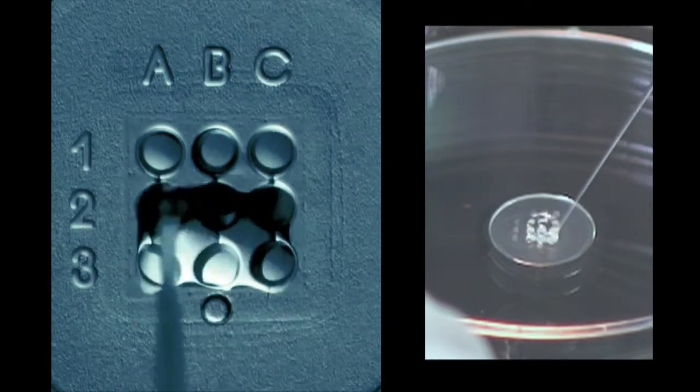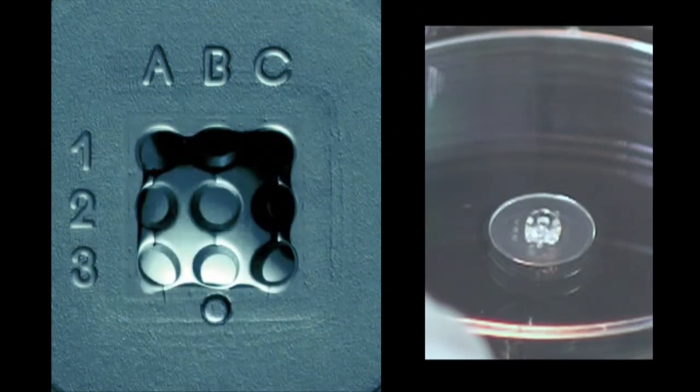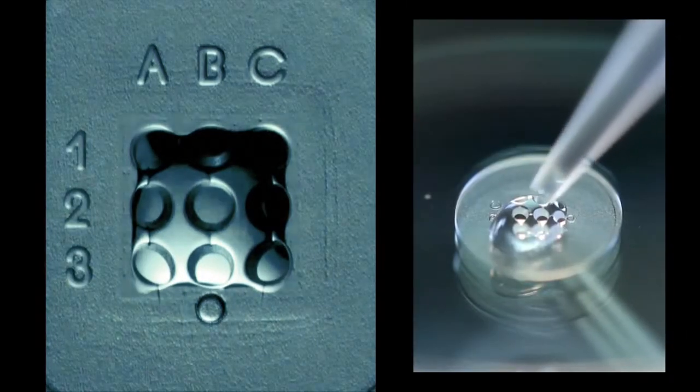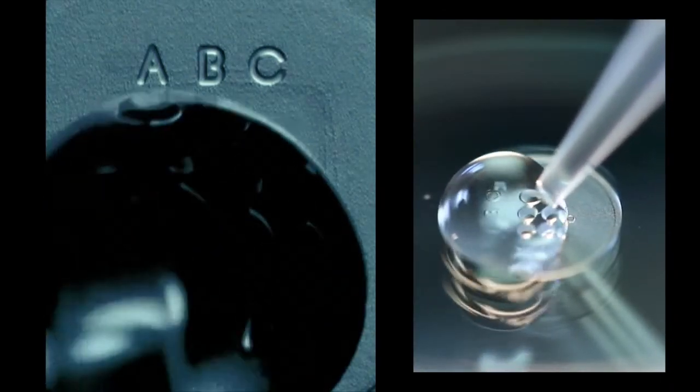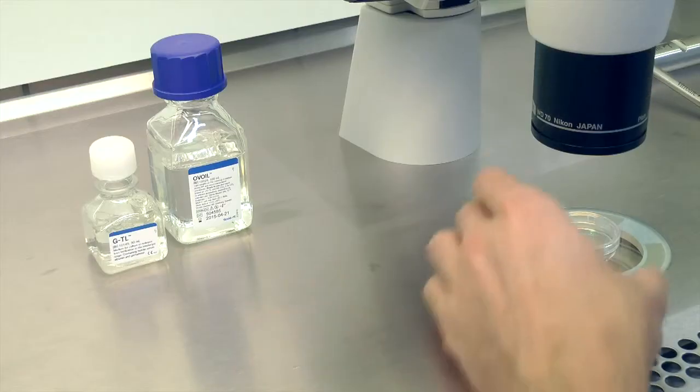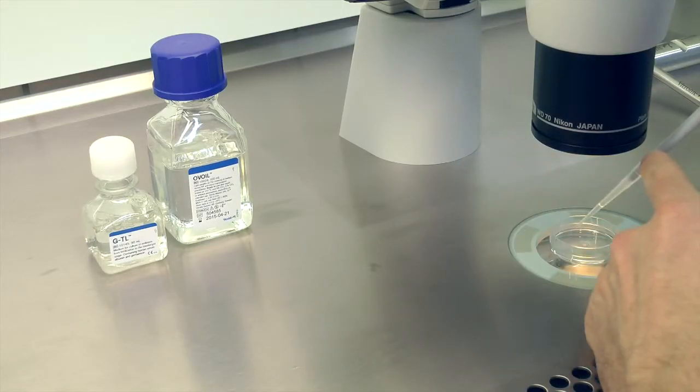The rim around the microwells does not mark the edge of the proposed culture droplet. The function of this rim is merely to stabilize the droplet of culture media. Add an additional two droplets of GTL as wash droplets and then cover it with oil.